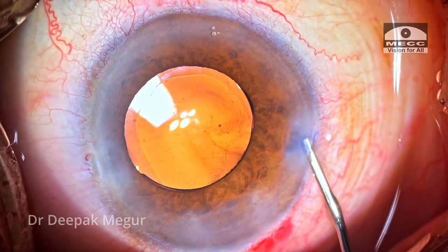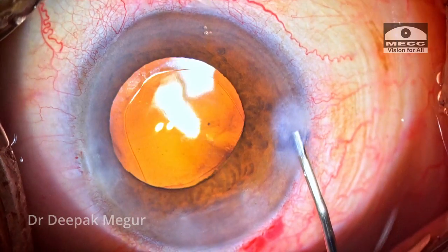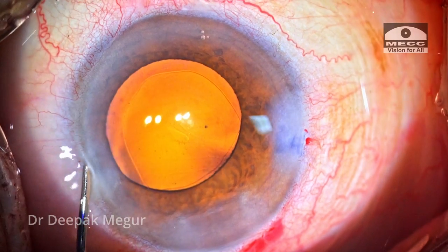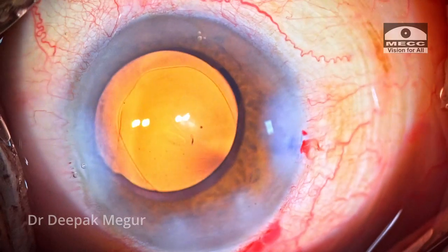Time to close. The side ports and the main incision are hydrated. The case is done. Thank you.